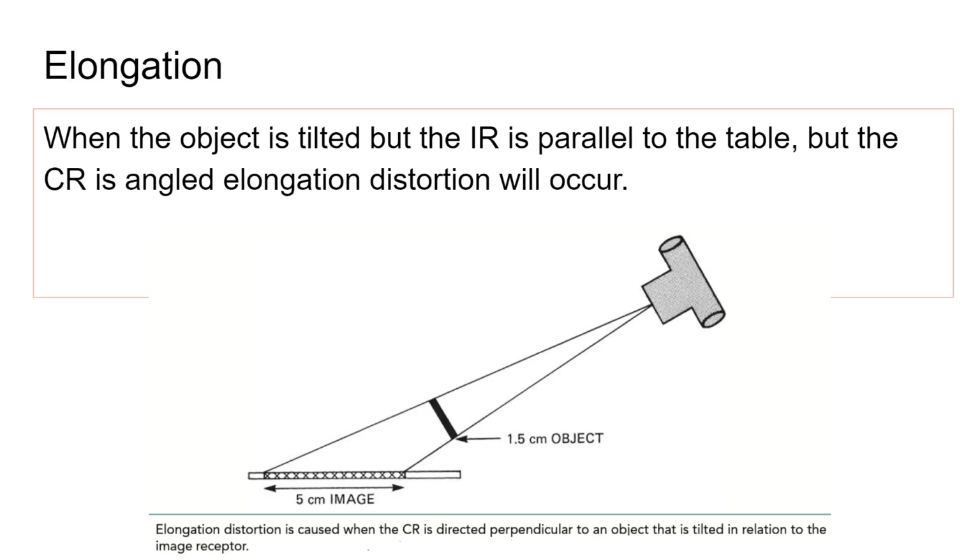So in a lot of cases, you'll see this, which is kind of unfortunate, but maybe not so bad for the patient in reality. A lot of times we're not doing the overheads. When I say overheads, that's the term for our turn to take our x-rays. It used to be the radiologist goes in there, does a bunch of stuff, then we would go in and do a bunch of stuff. And now we're not doing as many radiographs because the radiologists can see what they need. So I always have this dilemma.